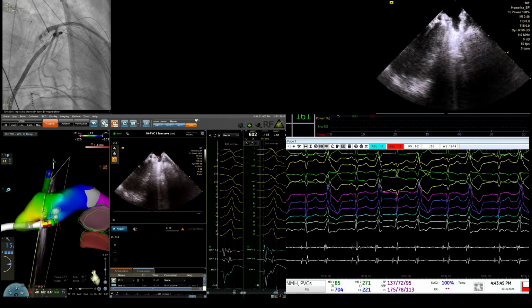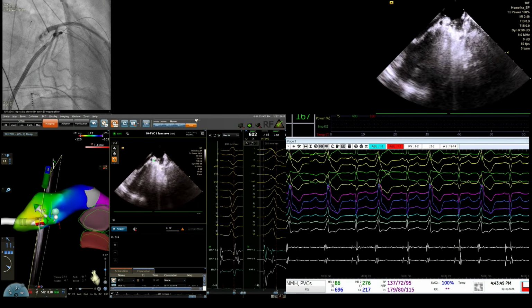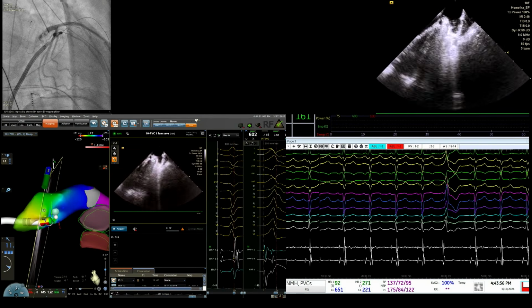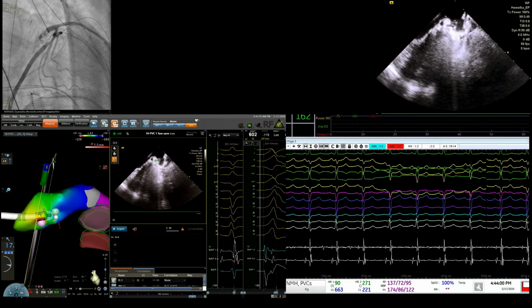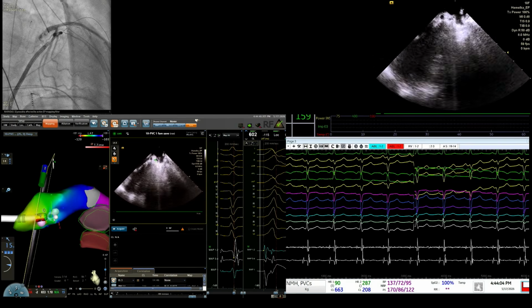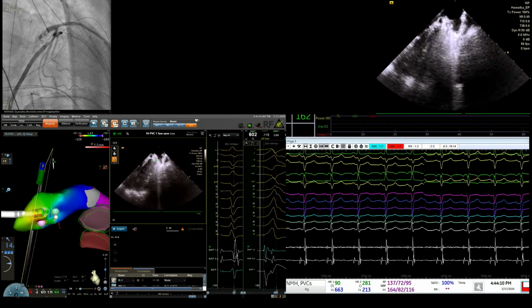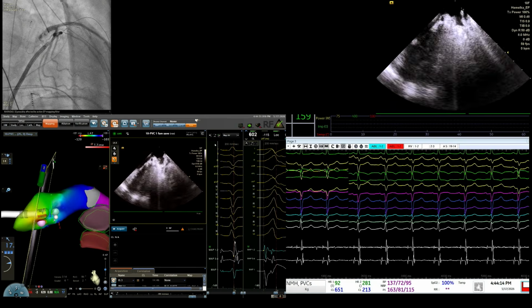Now, is she awake? You are ready for 20? Wait, I just need to get my vector down again. Just give me 1 second, please. Okay. You see, tip down, PVCs go away, just mechanical. How do we do this, Peter? Just mechanical. I don't know. Maybe we ablate a little bit forward. For this space map, even Mark Josephson will be happy.